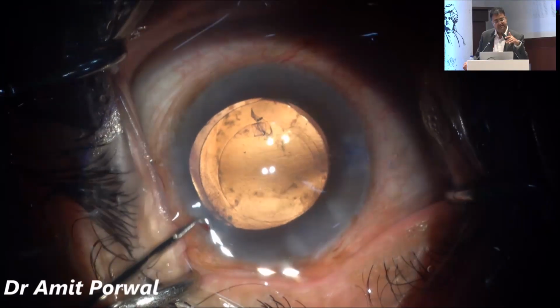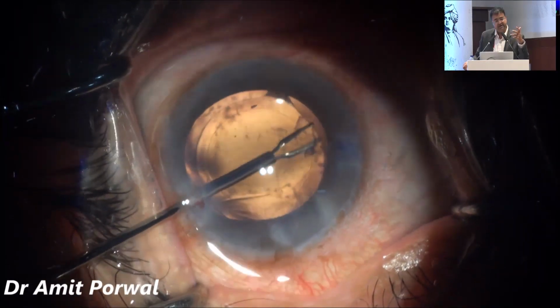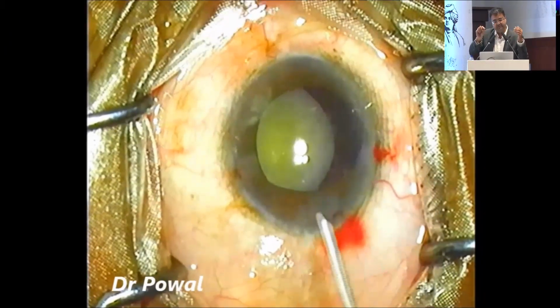If you are well versed with this, you start doing it with the irrigation port. Why the irrigation port is good is that the AC is maintained and the flap goes on moving around. So you get a better hold with the micro rhexis.